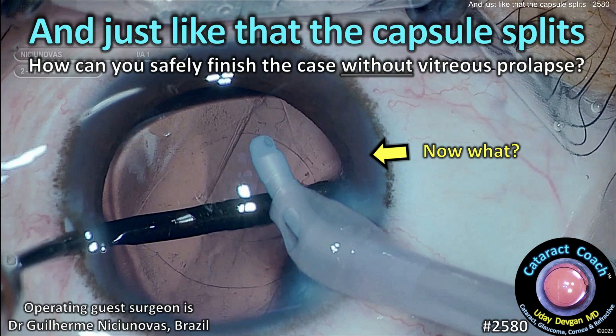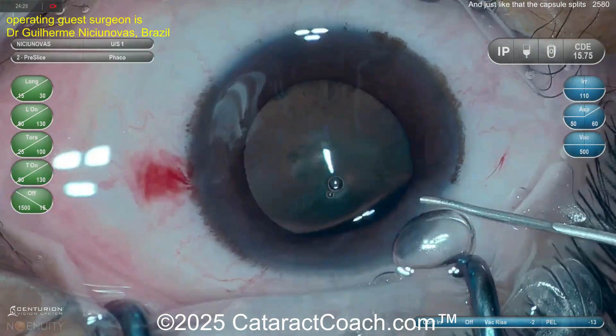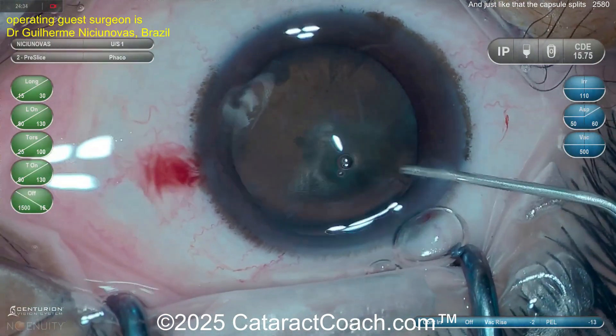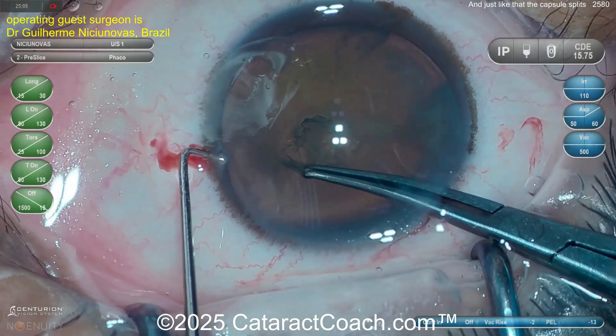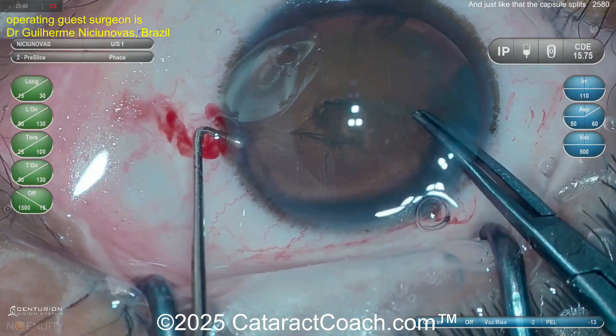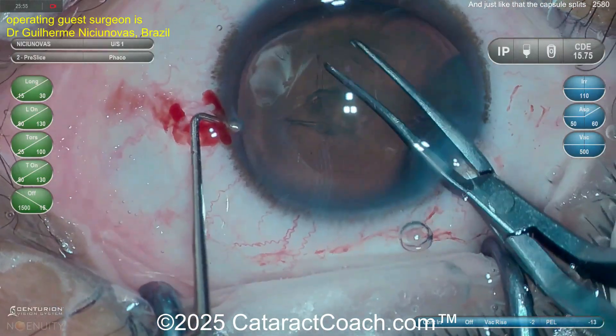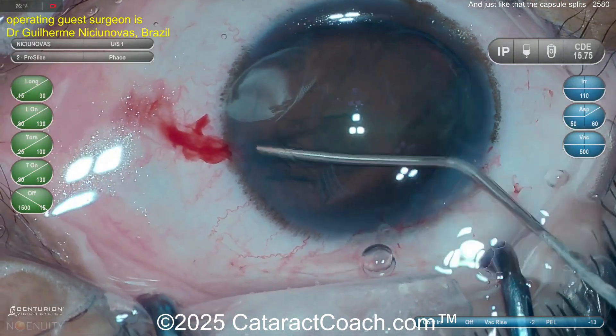Welcome to CataractCoach.com. Just like that, the capsule splits wide open — how can you safely finish this case without vitreous prolapse? Watch carefully now. Our guest surgeon here is doing a routine type of case; it looks all pretty good. Nice video, sped up a little bit, getting that capsule open very nicely. Sometimes you just can't predict what the tissue is going to do.